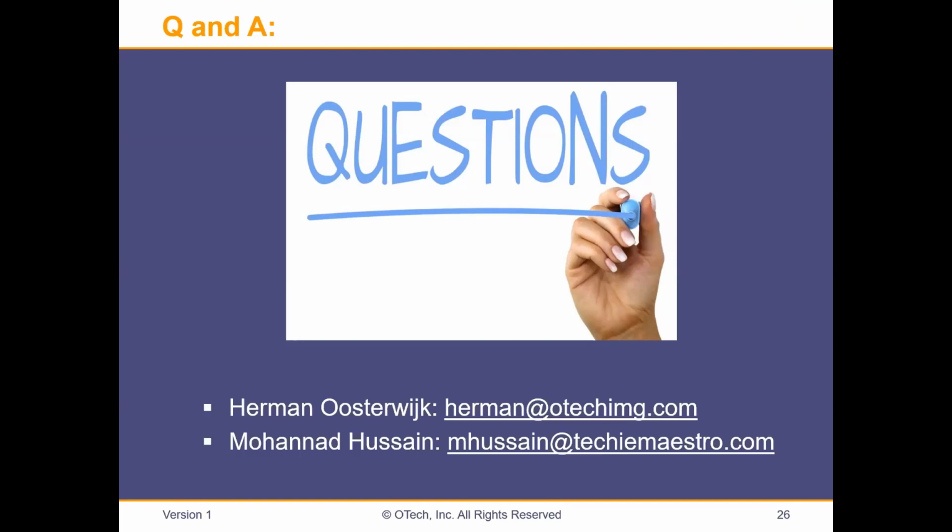Fantastic, sir. All right, I think the question of the hour, and we've circled around this a few times: when do you expect DICOMweb to be replacing traditional DICOM? Let me take a shot first. You could ask the same question about when FHIR will replace HL7, and I think they're in parallel. FHIR is the companion to DICOMweb, and both use web services. So it will definitely take a while.